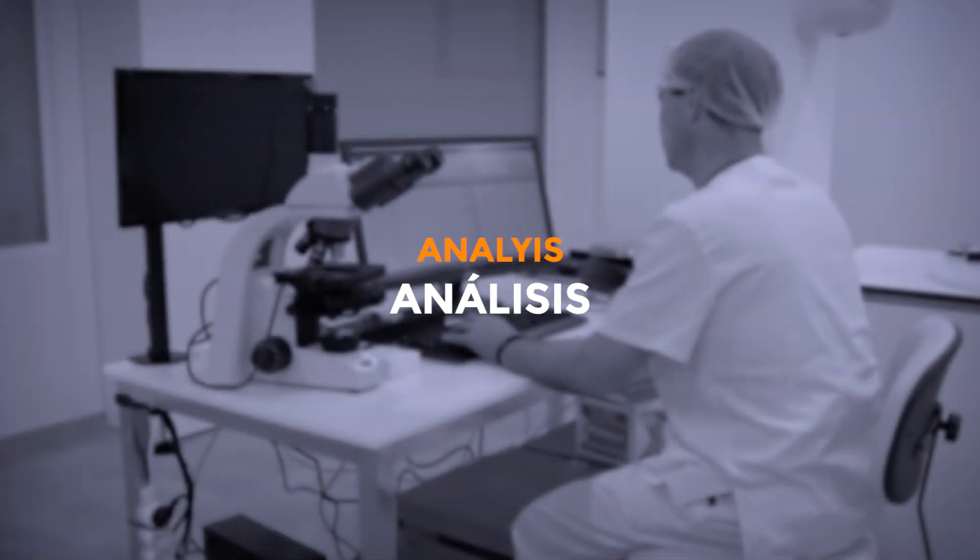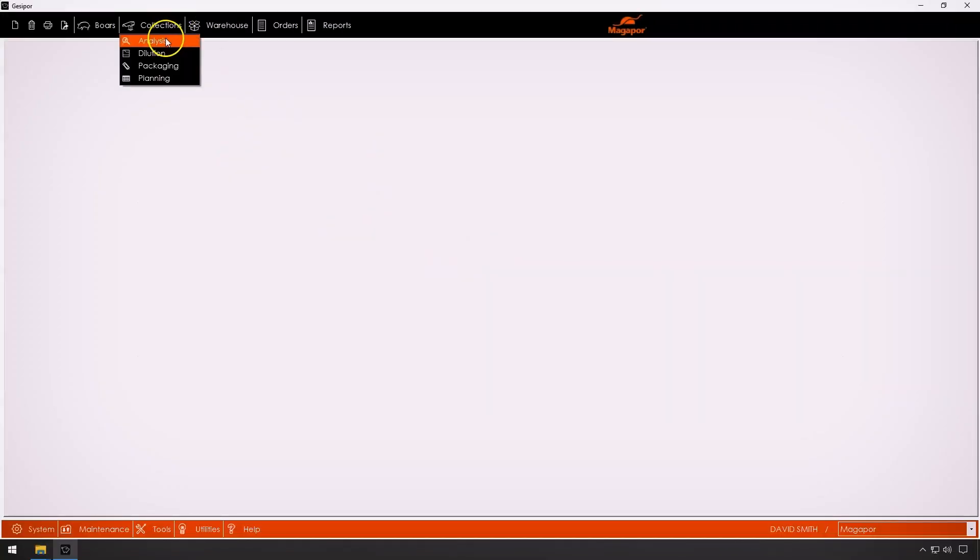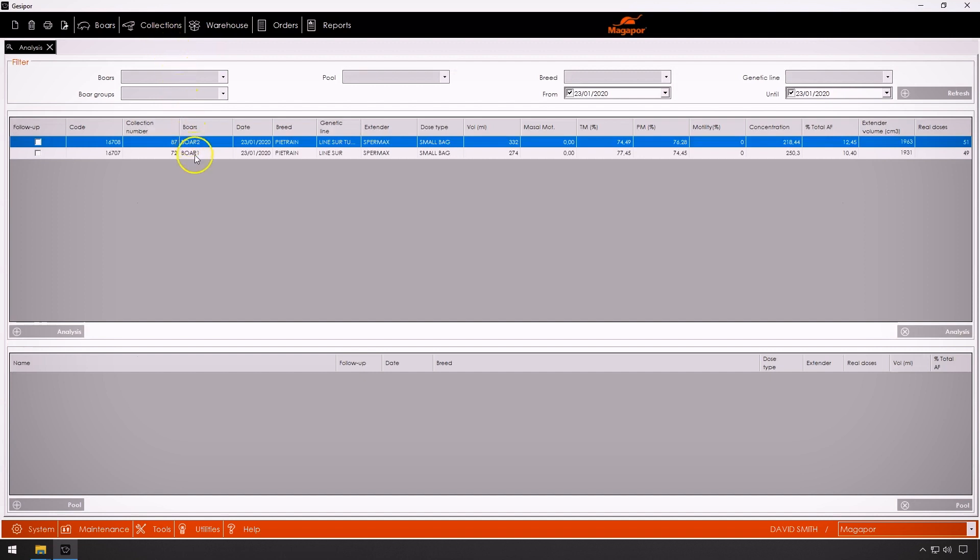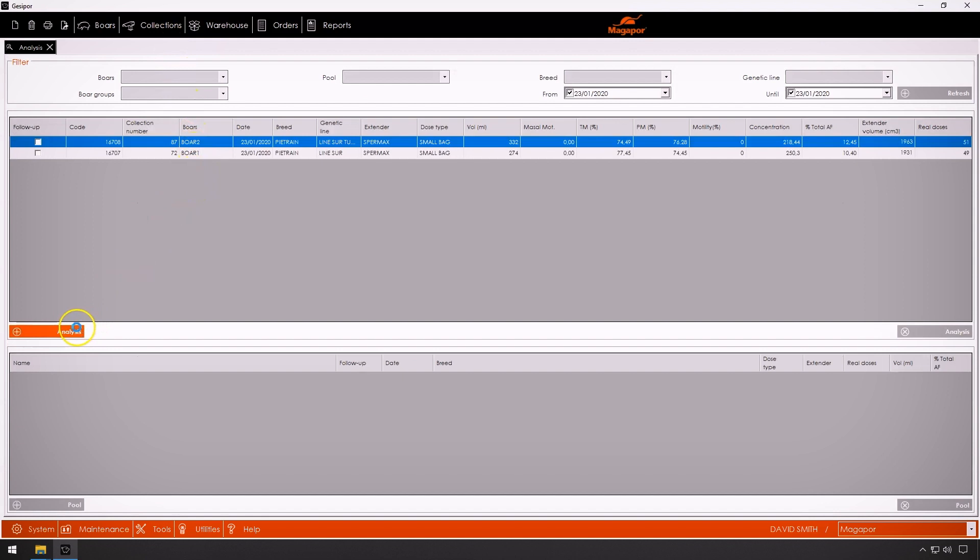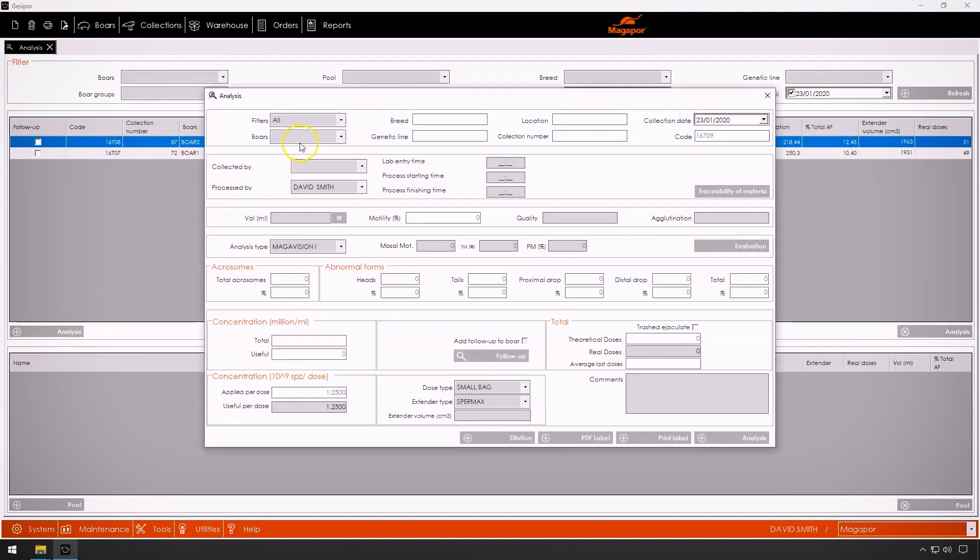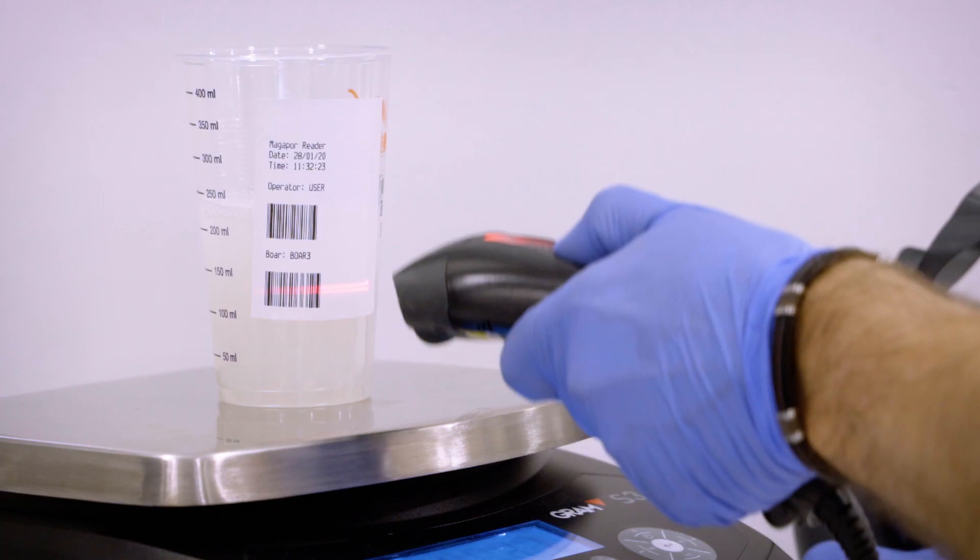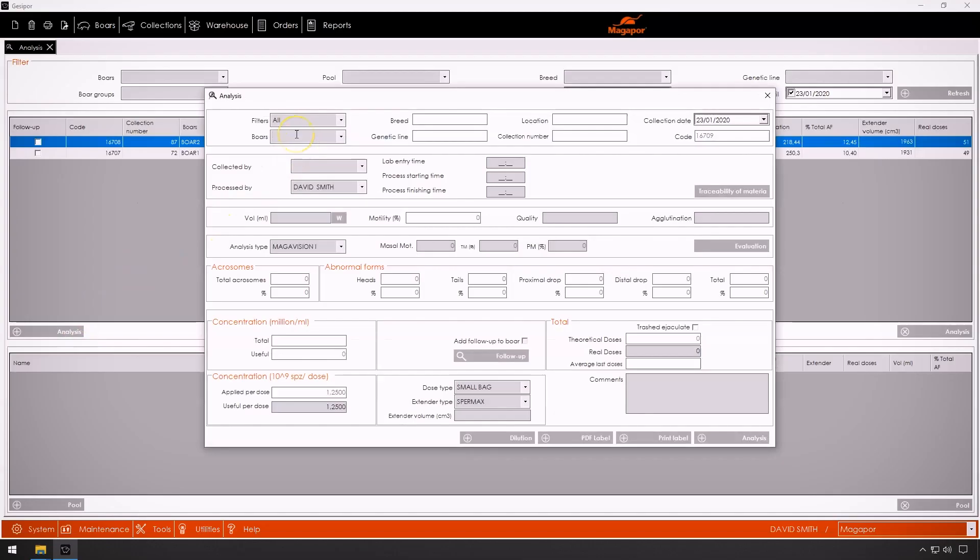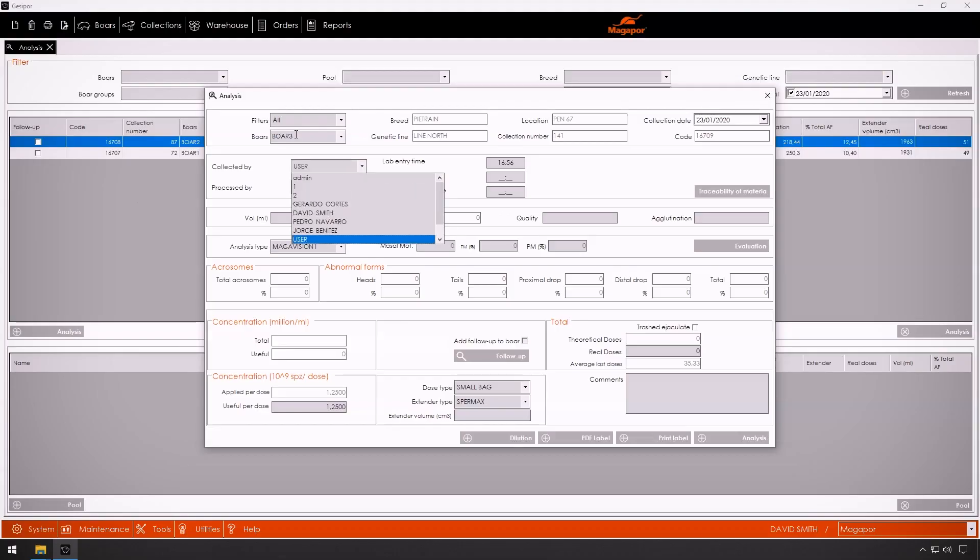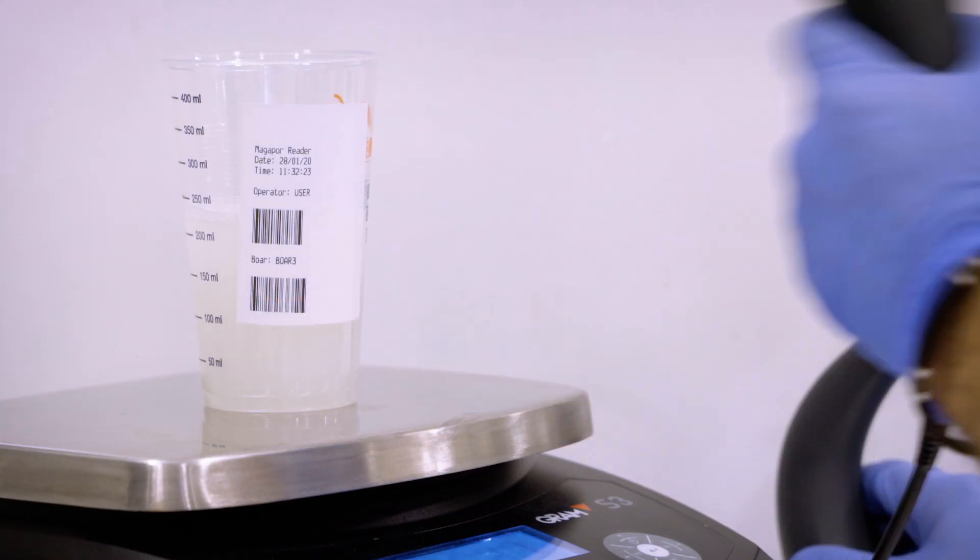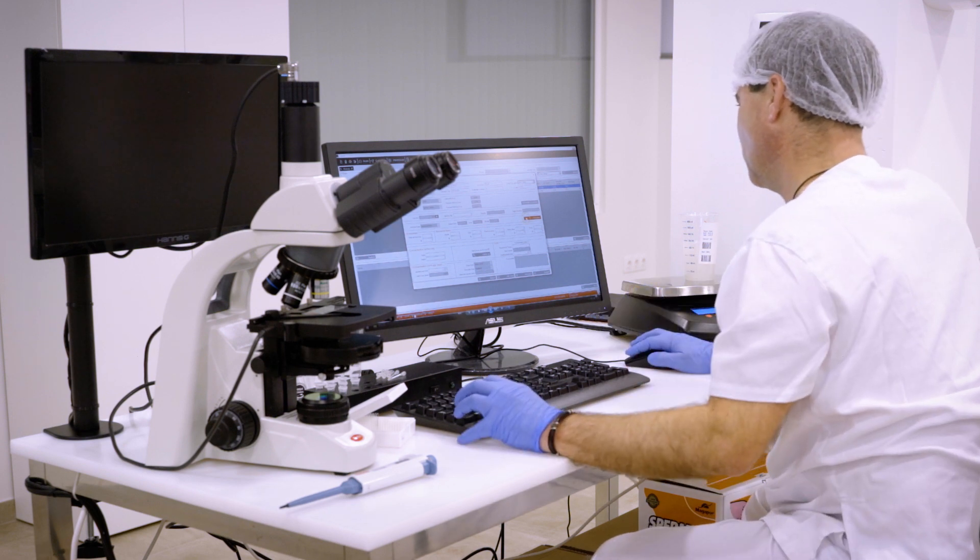For the analysis, Magapore has the Magavision artificial vision system, being the first CASA system designed exclusively for boar studs. By reading the barcodes of the identification label of the ejaculate, the identifier of the boar and the operator who has made the collection is automatically introduced. Also recorded are the analysis operator and the process start time and end time.